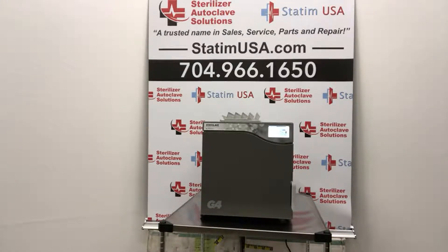Sycan is the manufacturer of the well-known Statum, the fastest autoclave on the planet start to sterile, and has a brand new chamber autoclave called the StatClave G4 Chamber Autoclave, shown in front of you. Sterilizer Autoclave Solutions is so proud to be among the first in the country to get our hands on one.